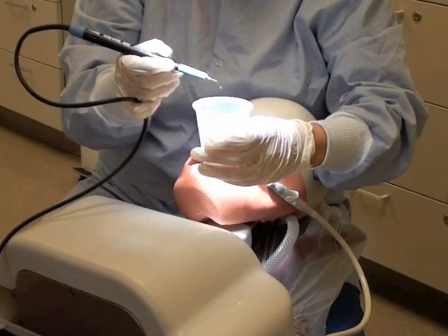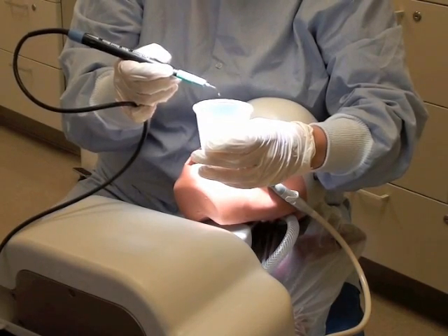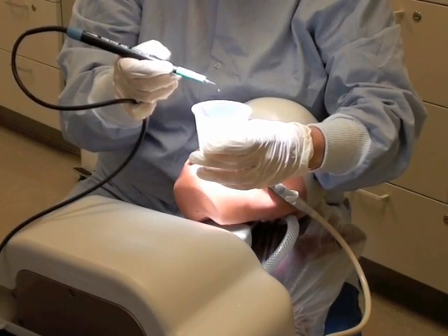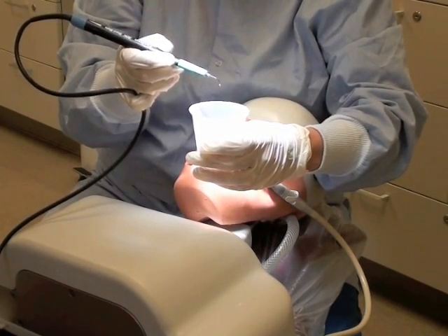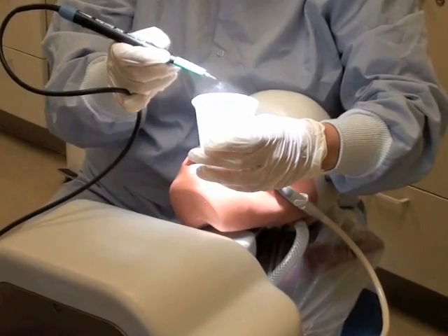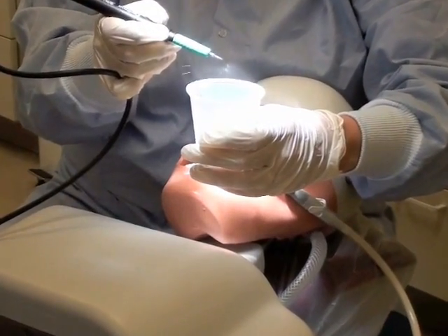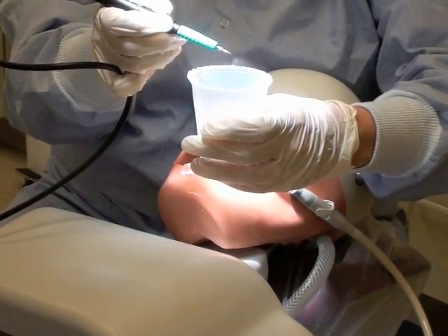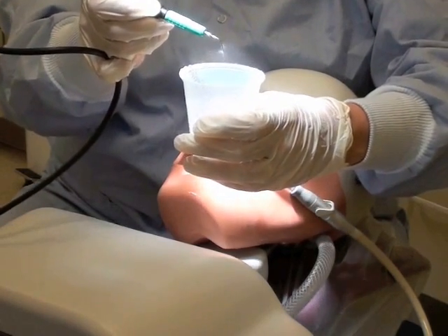One of the things you want to do before you go into the patient's mouth is to test the water spray. You'll be adjusting the power on the machine as well as the water on the handpiece. The appropriate spray for calculus removal looks like a halo of mist with possibly a drop or two coming out. It shouldn't be a steady stream, but a nice halo of mist.